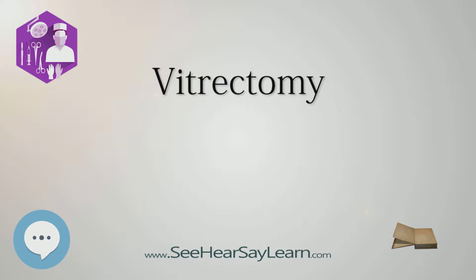The development of new instruments and surgical strategies through the 1970s and 1980s was spearheaded by surgeon/engineer Steve Charles, MD. More recent advances have included smaller and more refined instruments for use in the eye, and the injection of various medications at the time of surgery to manipulate a detached retina into its proper position and mark the location of tissue layers to allow their removal, and for long-term protection against scar tissue formation.